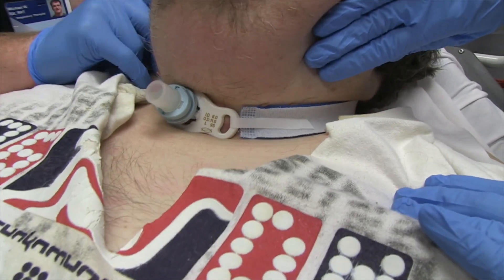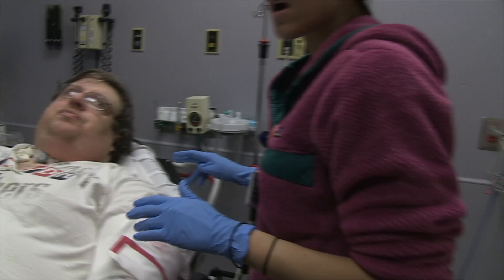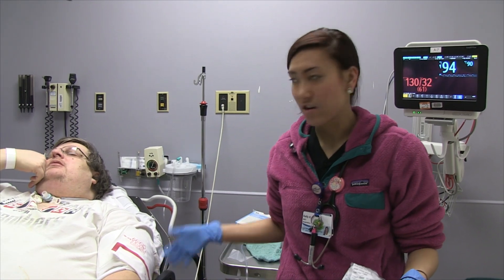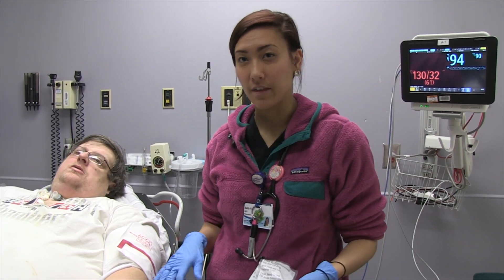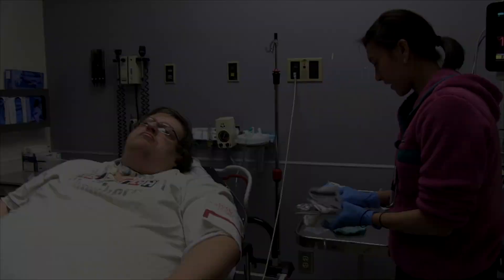How often do these need to be changed out? It depends — I've heard between three and six months. He gets his changed out every eight or nine months. The inner cannula itself should be changed out daily, especially if they have really thick secretions, but the track itself is about three to six months. Thanks for helping out.